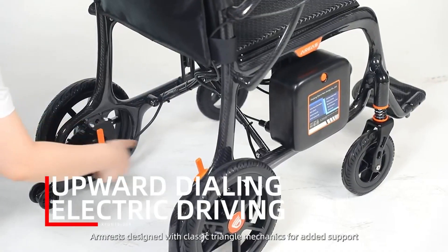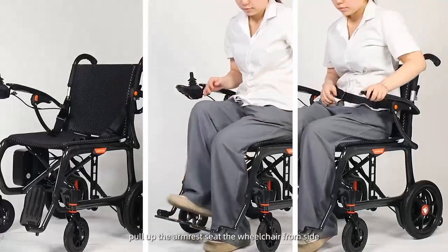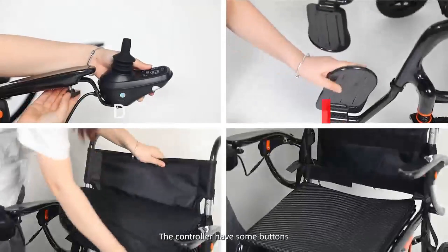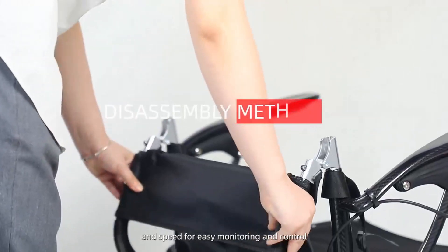Armrests designed with classic triangle mechanics for added support. Pull up the armrest to seat the wheelchair from the side. The indicator display shows battery capacity, and the controller has buttons to adjust speed for easy monitoring and control.